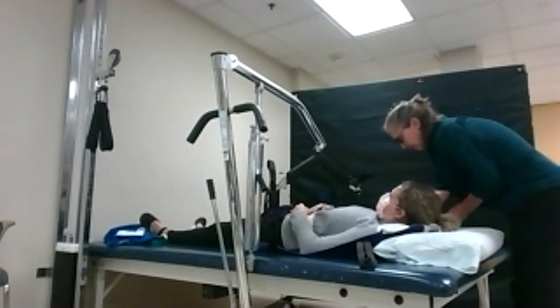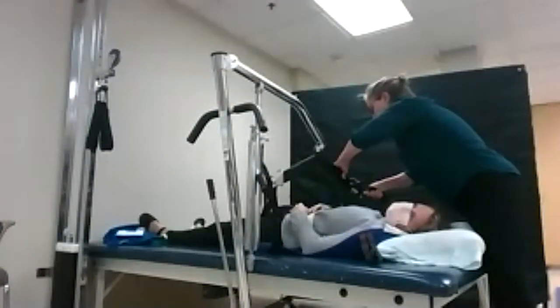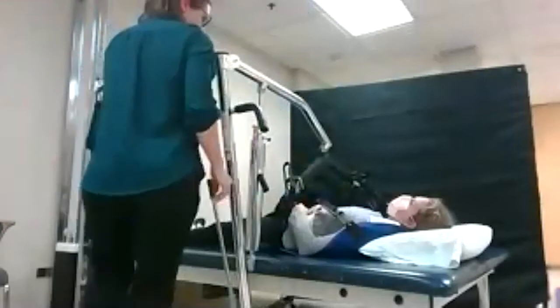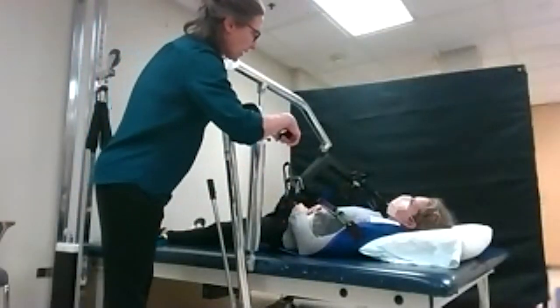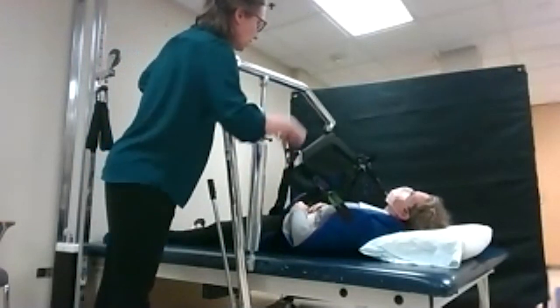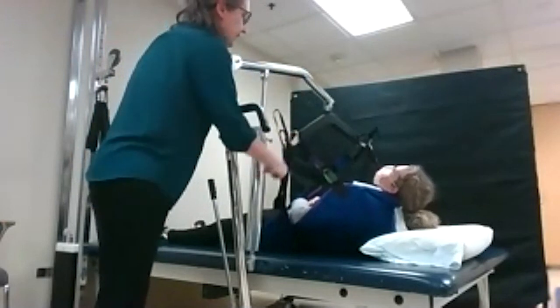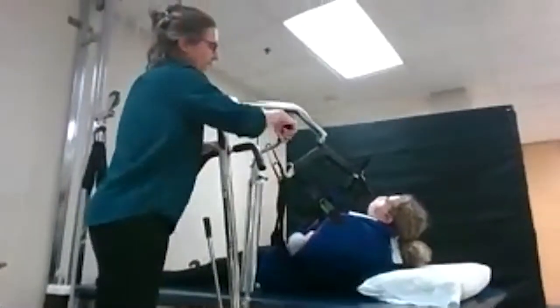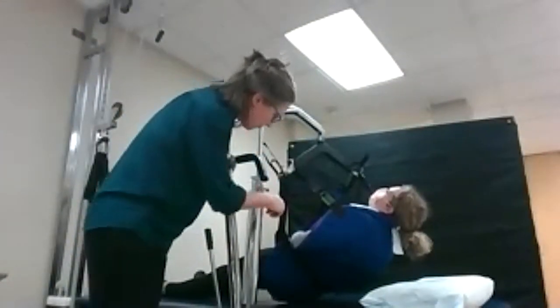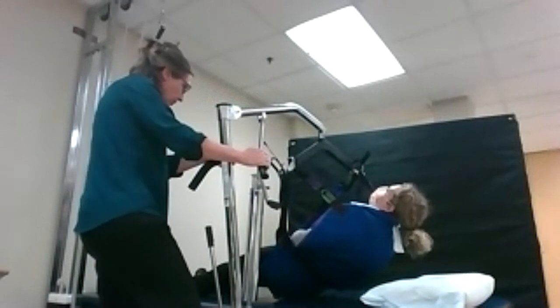We then have our head section and we're going to bring that up — starting with black on one side and black on the other side. Now I have six points of contact connected to her. This is a pump system, so it gently hugs her and it should be symmetric because you have all your colors matched correctly. In this example, I would prefer a little bit more head support and the sling a little bit higher — there are different slings that can provide more support. You can now see that her bottom is off of the table, so she is ready to do a transfer.